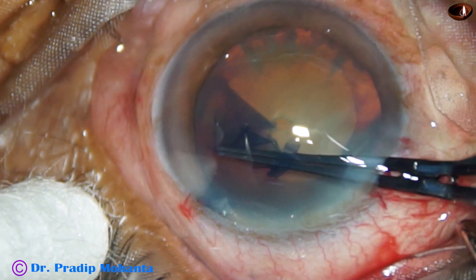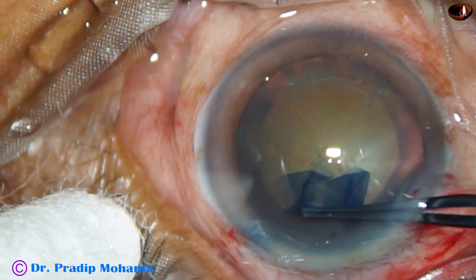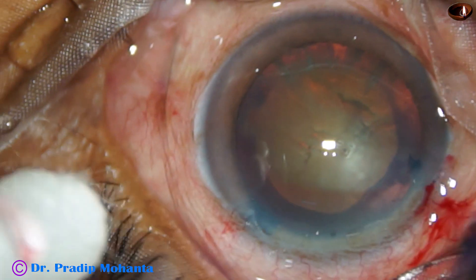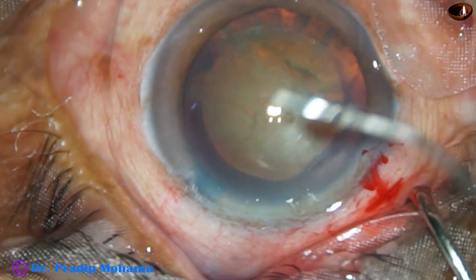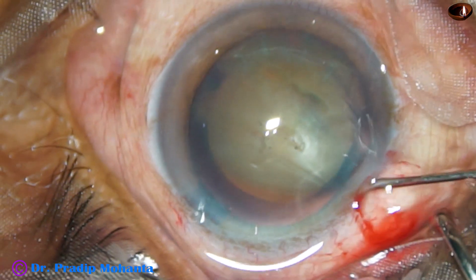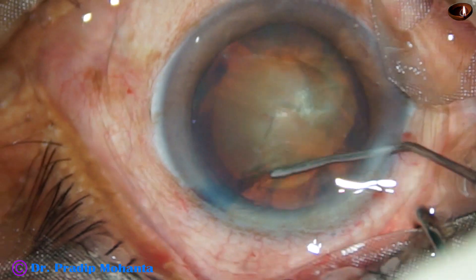Since this is a cataract with a hard nucleus, rhexis should be of adequate size — and this is quite adequate. The size of this rhexis is about 5.5 millimeters. Now hydrodissection. The cannula is passed just under the anterior capsular rim.